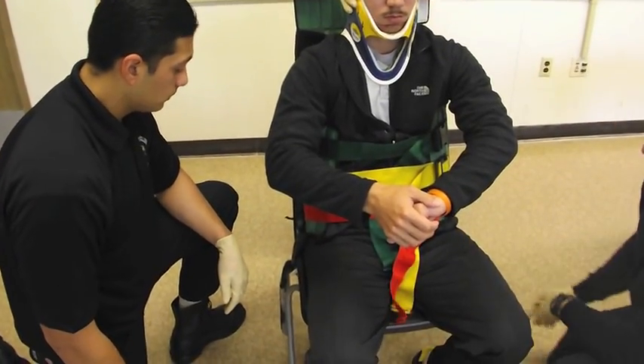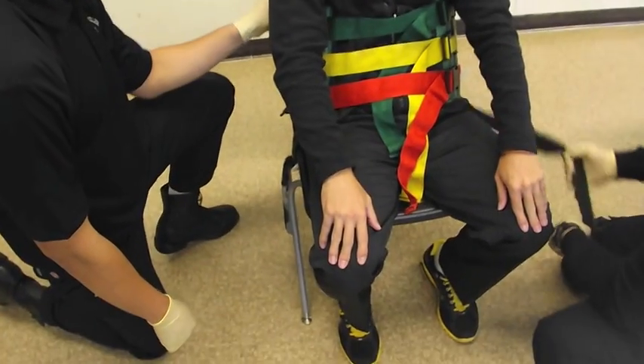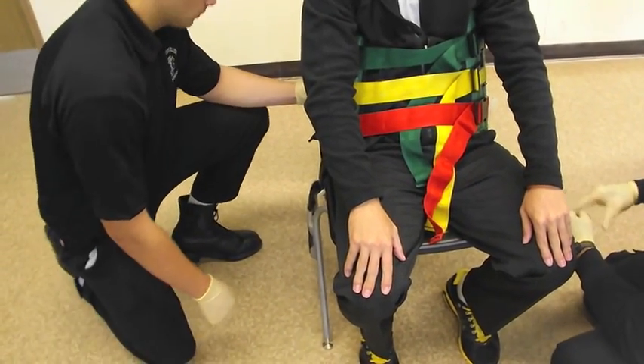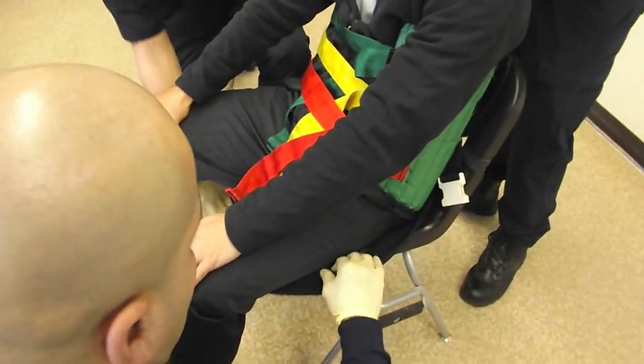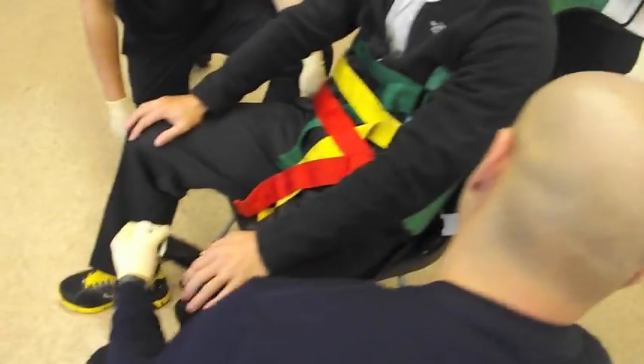Now with the three torso straps done, they're going to move to the harder portion: applying the black hip straps. To do this, they're going to have to work them under the patient's thigh and up into the crotch area. The reason for this is because this is going to create a seat for them so they can lift the patient up.